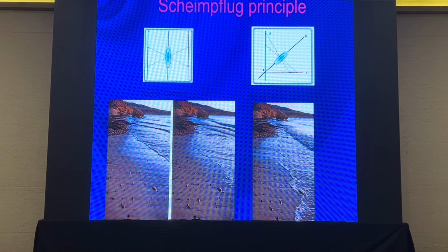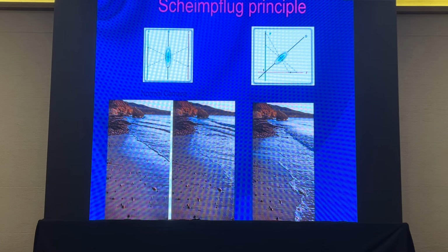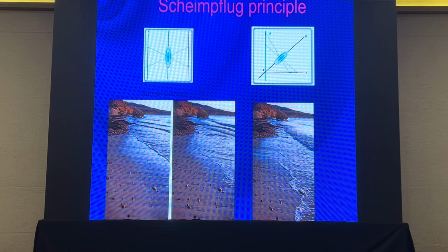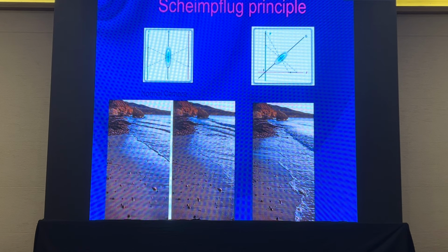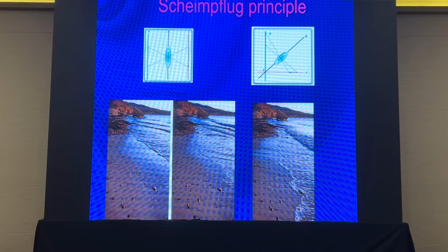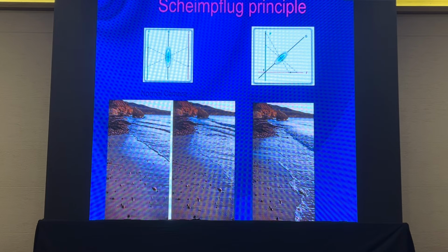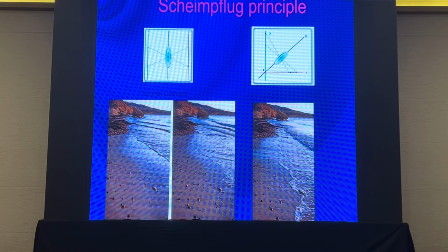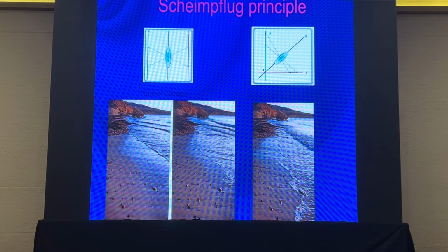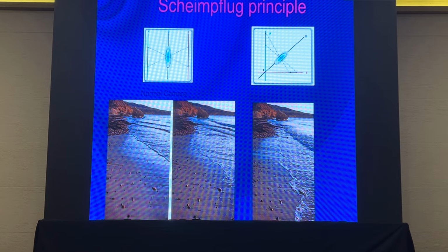So among the different tomography machines, what is most prominent nowadays is this Scheimpflug imaging, which is used in Pentacam, Sirius, and Galilei. If you look at these 3 images, in the first image you see that the rocks are well seen, while the beach sand and the small rocks, small pebbles, are not in focus. While if you focus on the small pebbles, the distant images do not come into focus.